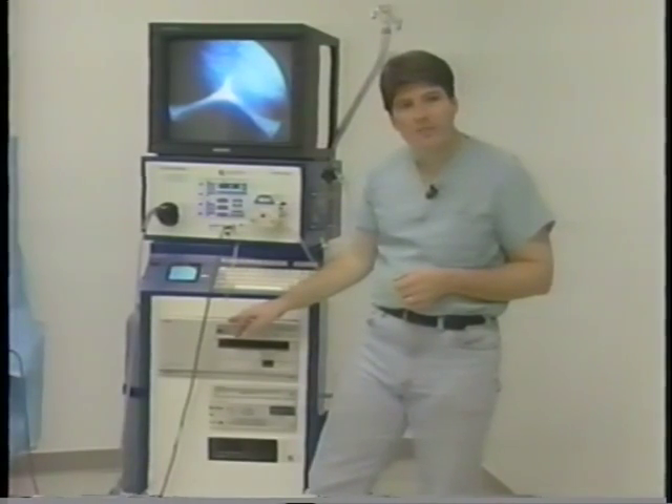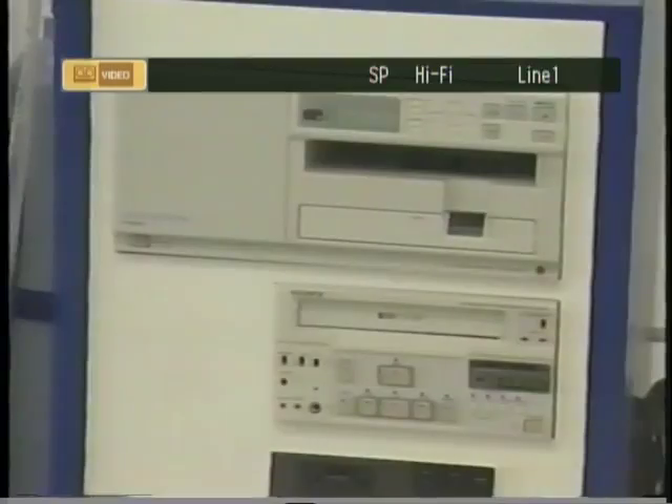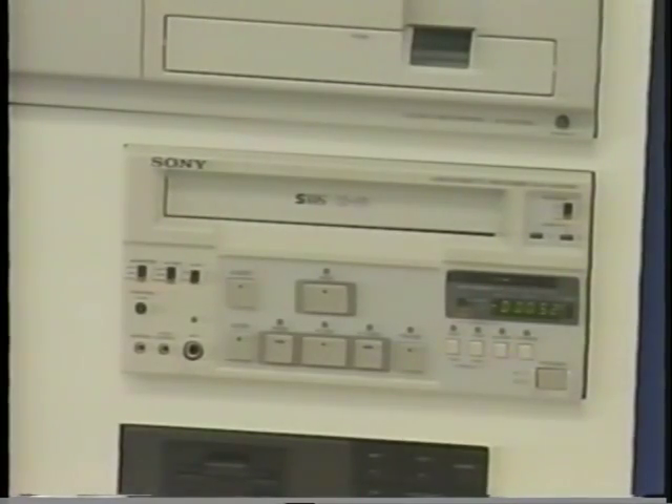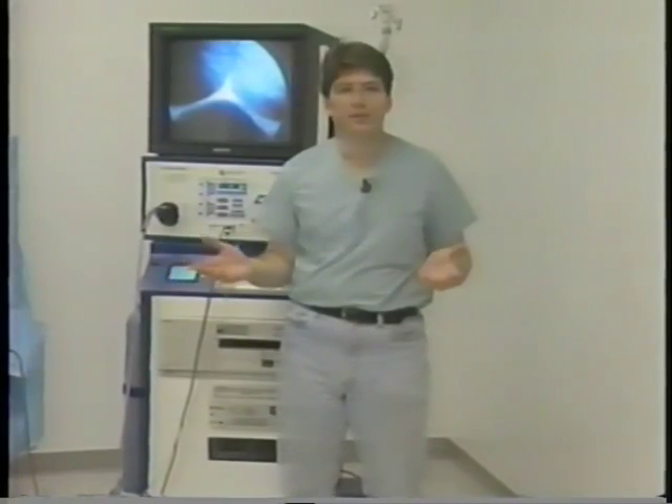Inside the system, we also have two types of video printers: a high resolution and a low resolution. The only real difference is resolution and price — the greater the price, the greater the resolution. We also offer two types of VCRs: S-video and standard video. Both are available, and again, resolution is directly proportional to price.